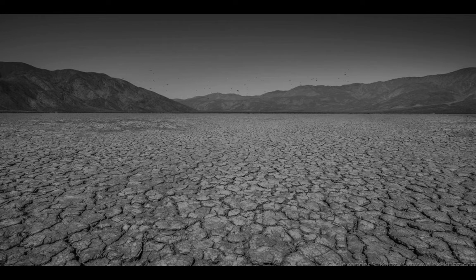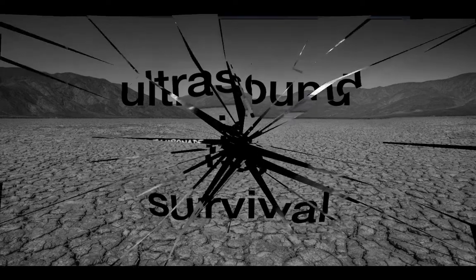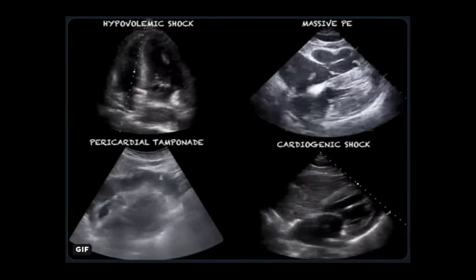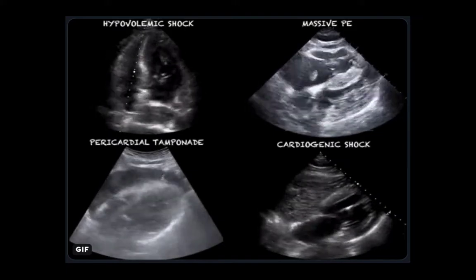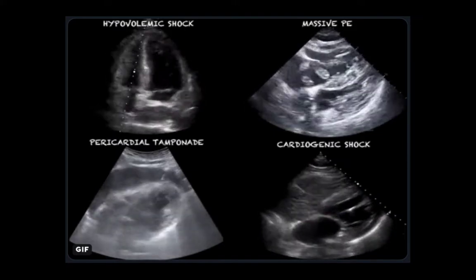And if there's one thing I want you to take away from this lecture, it's that ultrasound is survival. And what I mean by that is that in these cases, ultrasound is one of the things that really helps us to rapidly identify what's going on with the patient in order to save a life. So in this lecture, we're going to talk about the how.